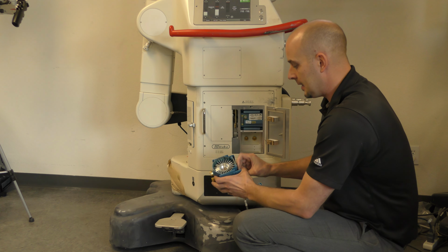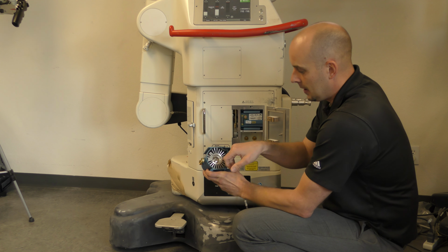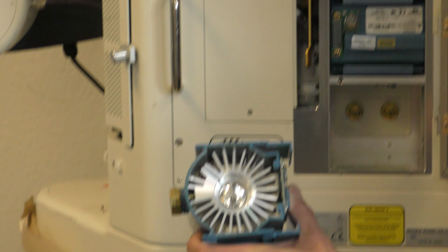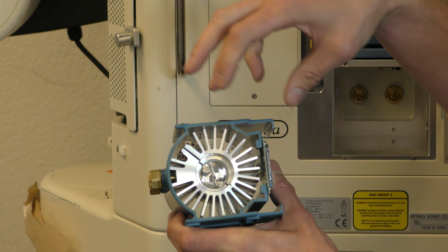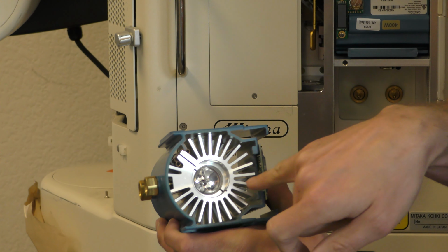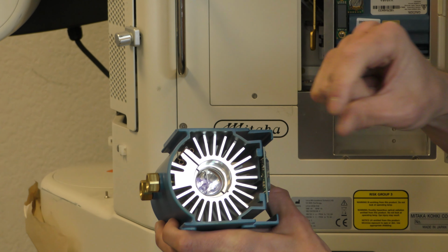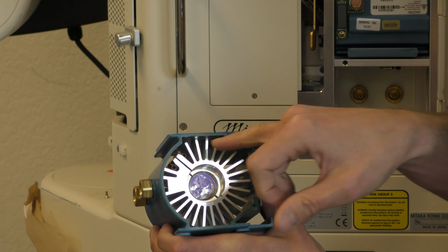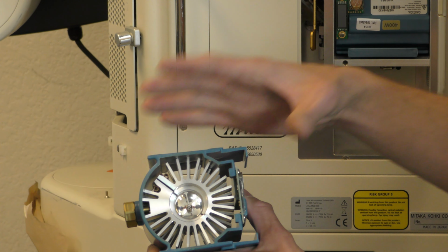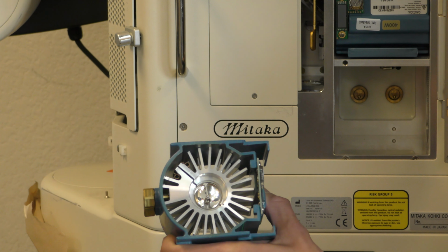So at this stage, the next thing I do is I'll pop this off. I'll pop these out, and I'll look at the heat sinks. On the inside of these heat sinks, if there's a lot of dust that's accumulated over time, and this has a little bit, but you'll see it where there's a ton of dust bunnies on the inside there. And on the inside of this reflector, on the back side, the mirrored reflector, sometimes you'll start to see black burning. If I see black burning and a lot of dust on the inside of this heat sink, that's strike 2. So typically, if I have 2 or more strikes, it means these bulbs need to be replaced. I don't even question it, right?